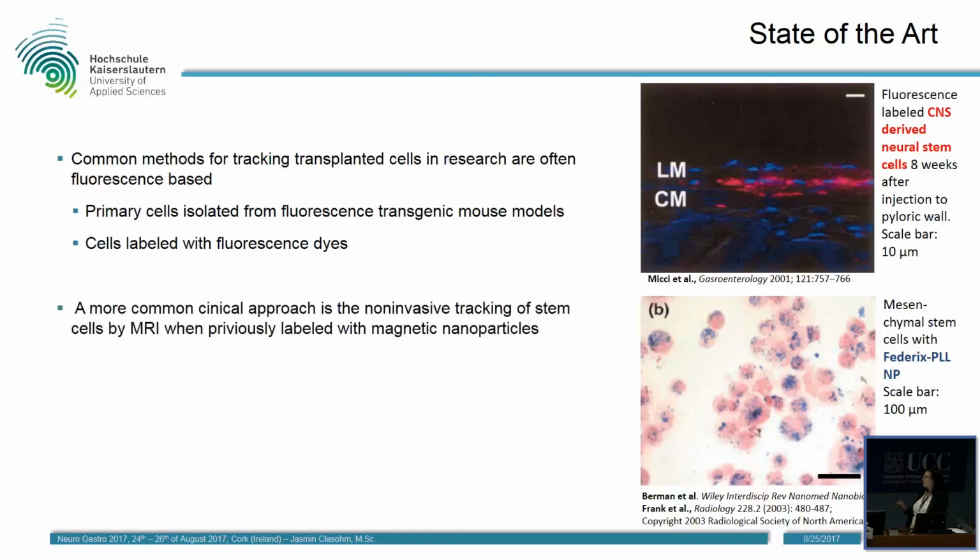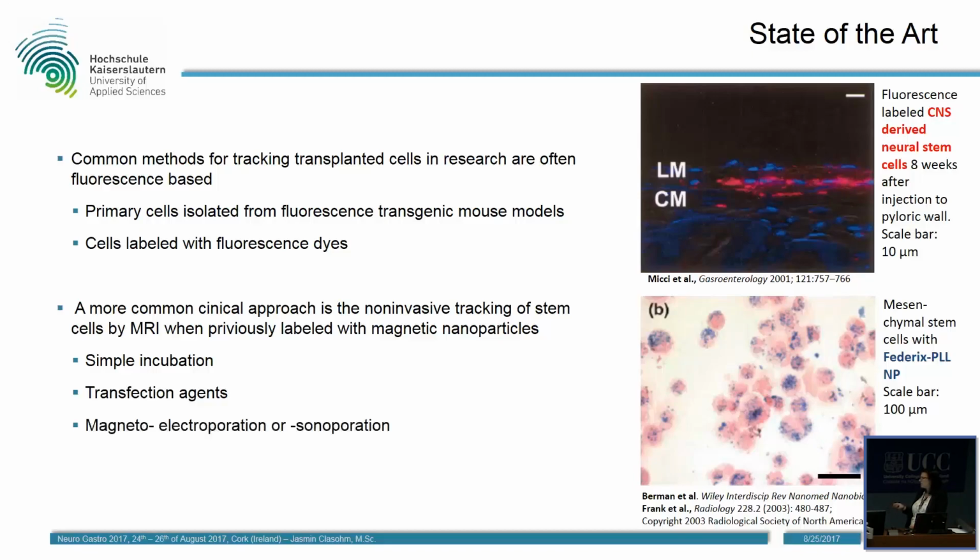A more common clinical approach is the non-invasive tracking of stem cells by MRI when these cells were previously labeled with magnetic nanoparticles before. Therefore, several techniques can be used. For example, the simple incubation of nanoparticles together with the cells. Transfection agents can be used, even magnetoelectroporation or sonoporation.